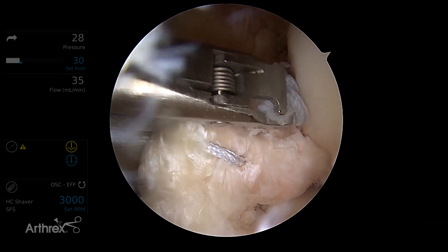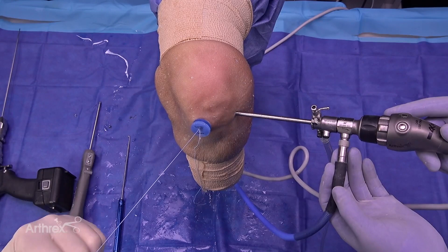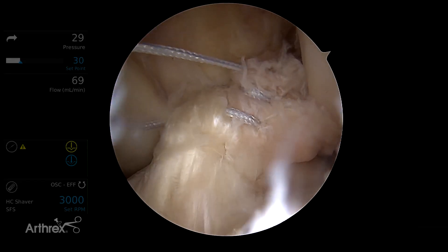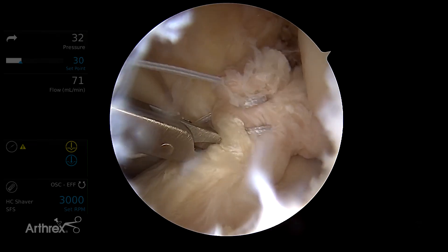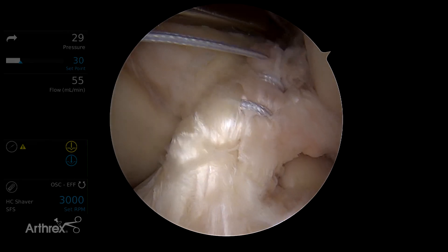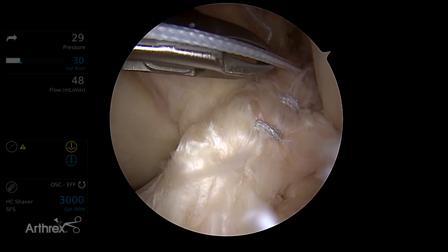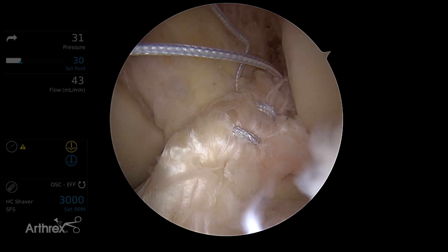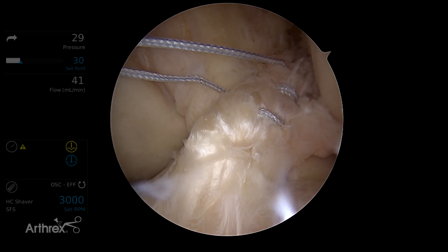You can see the angle of the scorpion so we don't hit the wall. On the AM bundle, when I exit at the end, I've got a stitch limb coming out of each side of the AM bundle — that's the way we want it. That's a little different from the PL bundle, where we're going to try and have both limbs of the stitch coming out towards the wall.